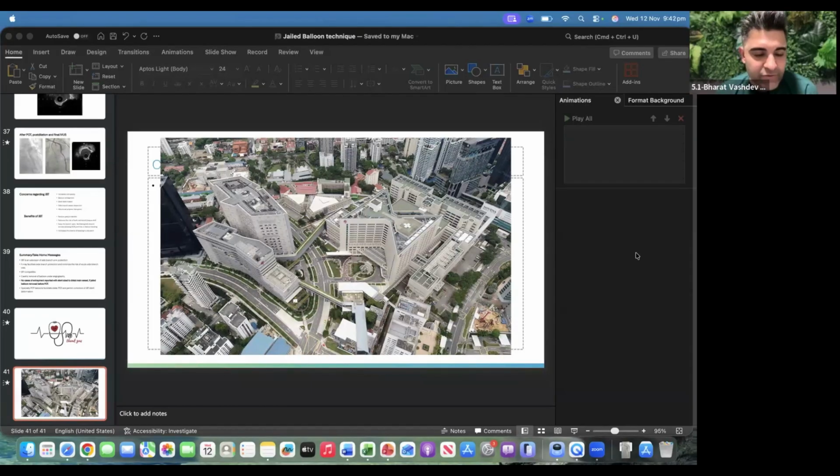Yeah, one of the things I didn't really mention is what happens if you do get a pinched side branch, even though you've put the balloon there. So one thing you can do is just inflate the side branch slightly, leaving the stent balloon there. And then you get your flow back, and then you've got time to work out what you need to do, recross and kiss. So in this case, I would inflate it at like 2, 3, 4 atmospheres, just to get the flow back. Absolutely. You don't want to cause too much deformity.